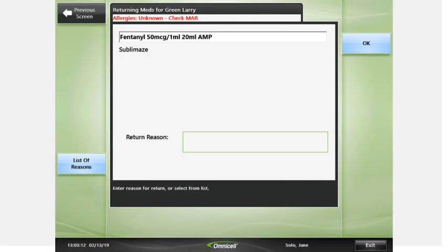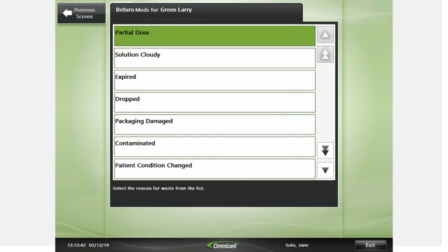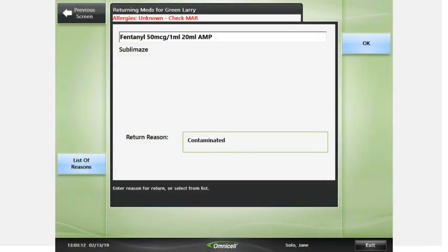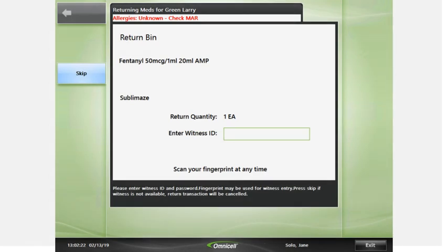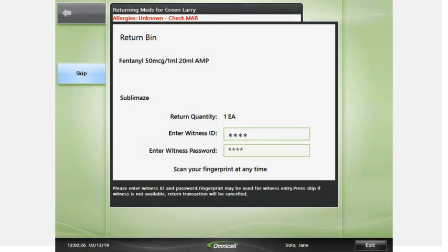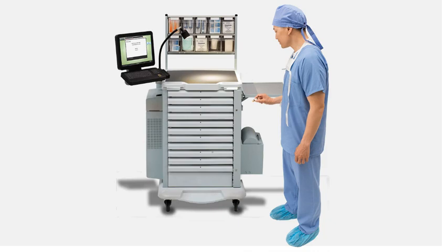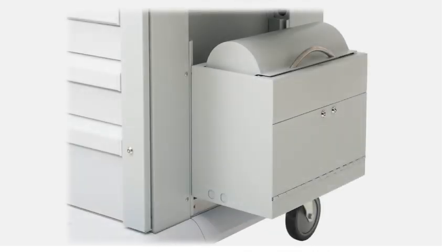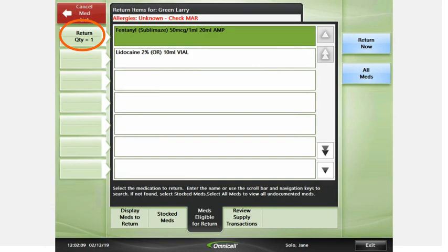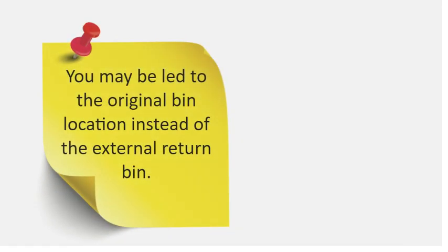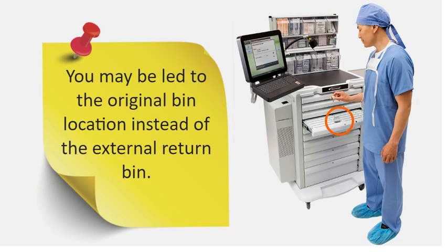Enter a reason for the return, then press OK. Have your witness enter their user ID and password if prompted. The external return bin unlocks and you will place the medication in it. Close the return bin to complete the return of the item. The screen now displays the return quantity left of the medication. Depending on how your facility is set up, you may be led to the original bin location instead of the external return bin.